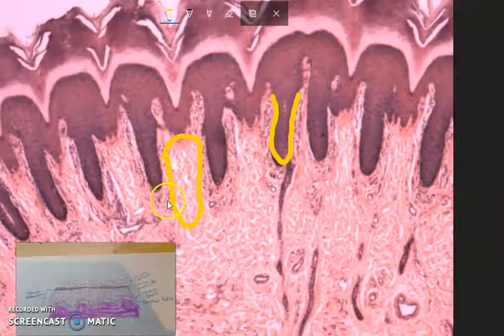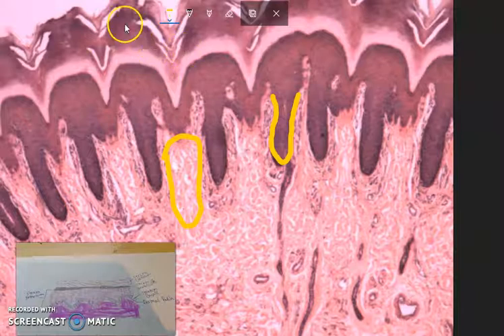Now you'll notice we have 5 layers and not 4 layers. Again, we have a basale, we have a spinosum, we have, again, a very thin granulosum. This is why it's called lucidum. It looks clear. Then we have a lot of these shingle-like cells for the stratum corneum.